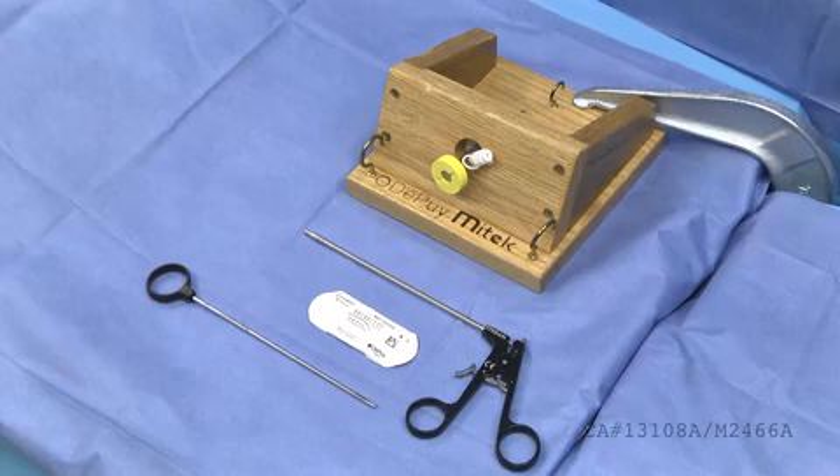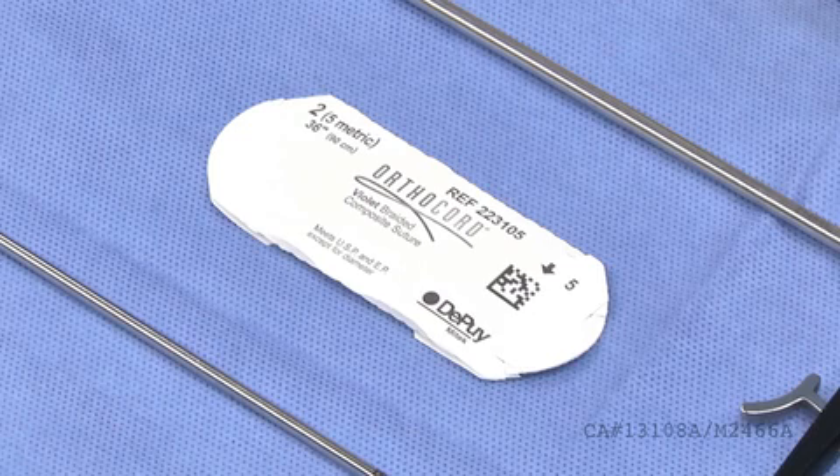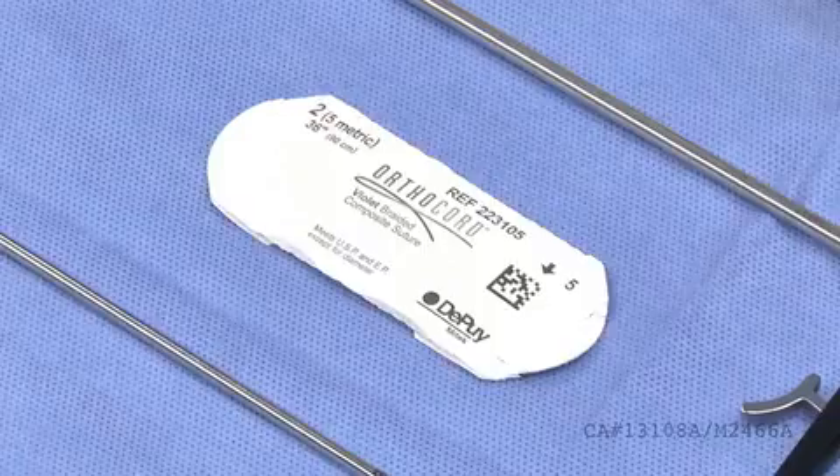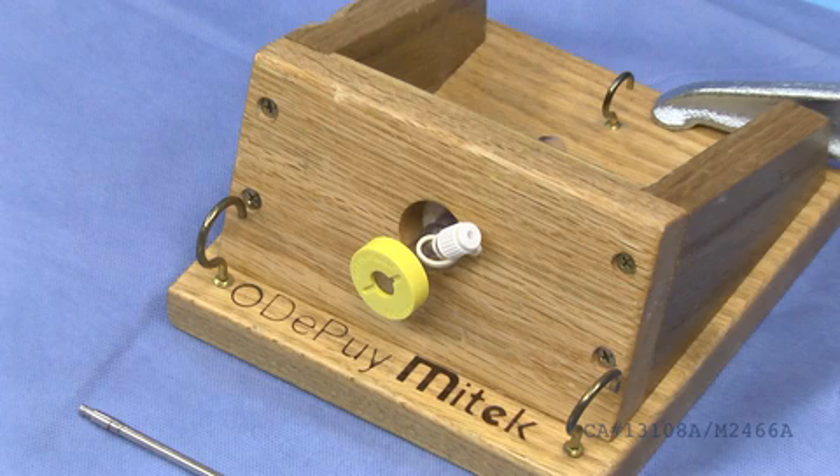To demonstrate and learn knot tying, it is ideal to have the following items shown here: a knot pusher, free strands of ortho-cord suture, a cord cutter, and a knot tying station.